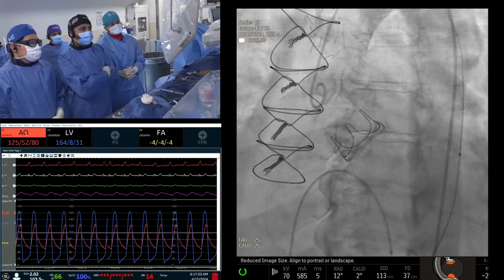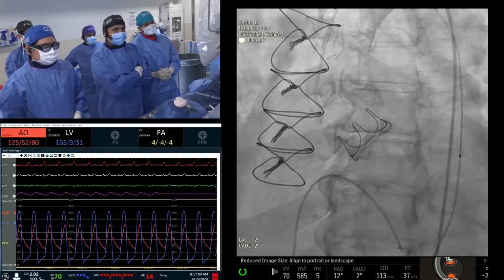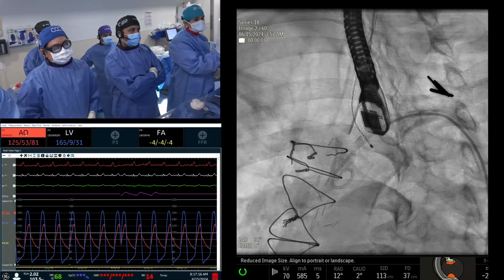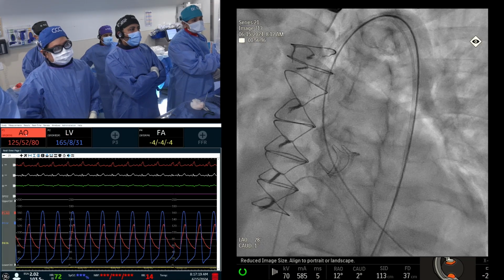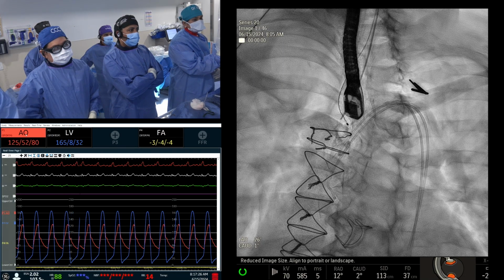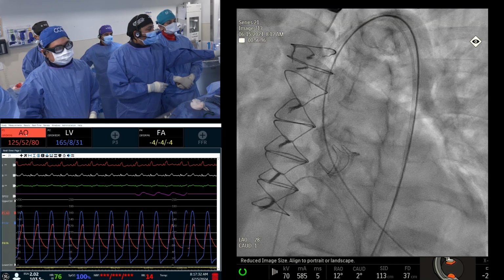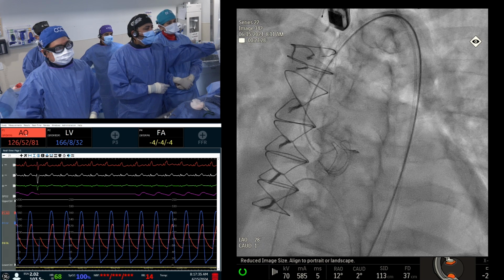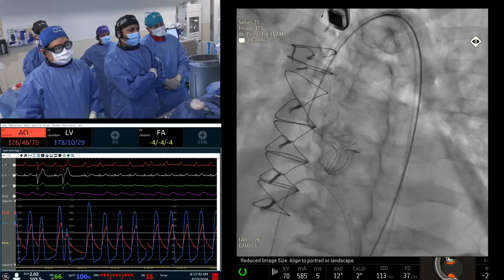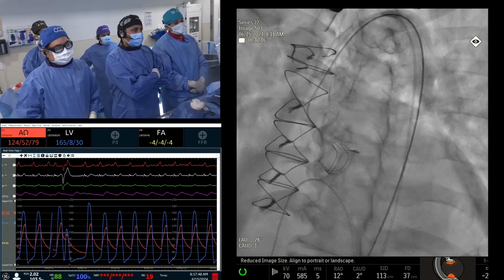Ideally, when you have this surgical prosthetic valve, we would like to use AR1 to cross, and likely in the RAO view rather than the typical LAO view. Here, because of the reconstruction, the root was definitely dilated. So I think we can show you how we crossed. Okay, good. It's not playing either. Yes, this was our AR2, and I had to go to the LAO view to see, on pause, to make sure we are facing the valve.